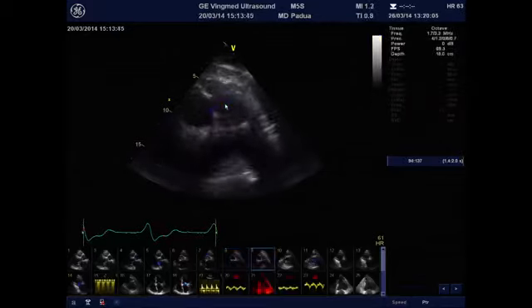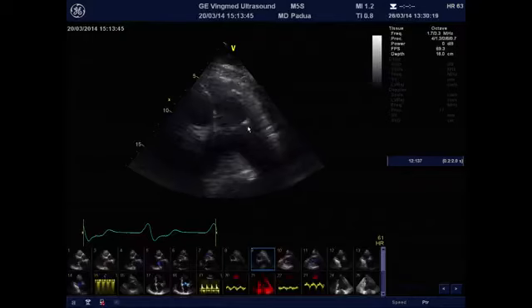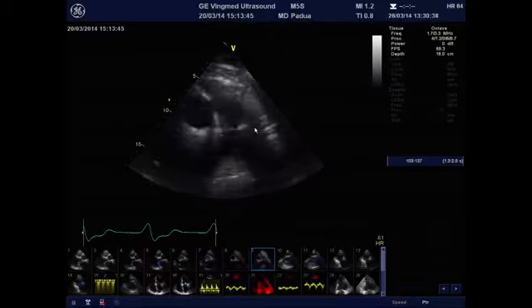Then I go and look in detail at the pulmonary artery. This should be done particularly when there is a recent heart transplant, to look at the suture line of the pulmonary artery if there is any leakage or any stenosis. This is a quite rare complication, but it may occur, and the first examination immediately after heart transplant should look at the suture at the pulmonary artery as well as those to the aorta.